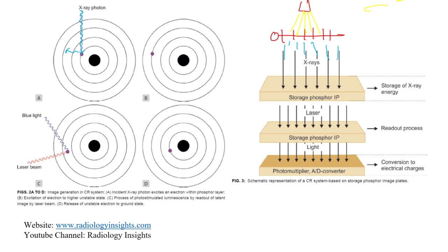Here it stays in this state. So the X-ray image is logged as a latent image in this stage.